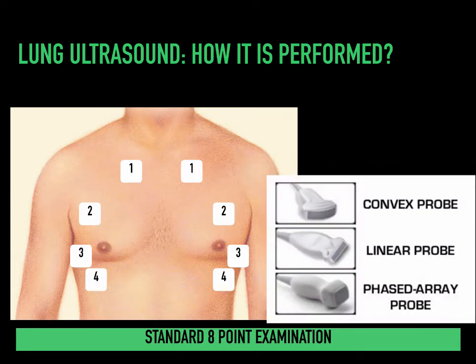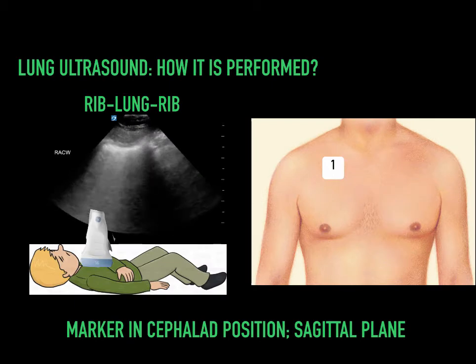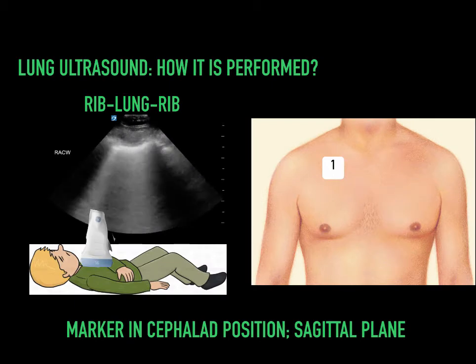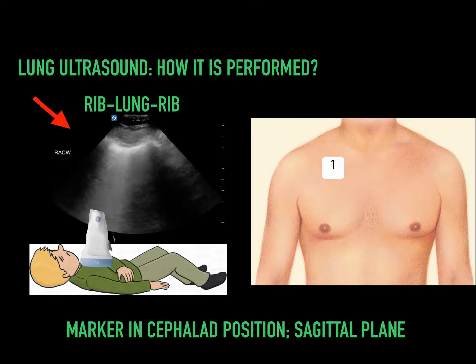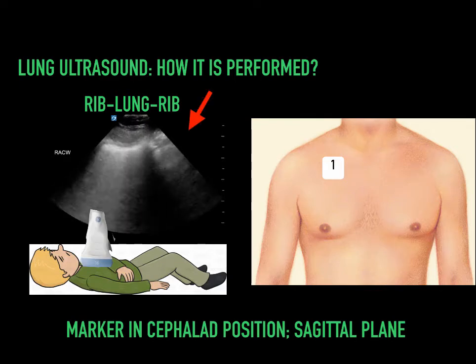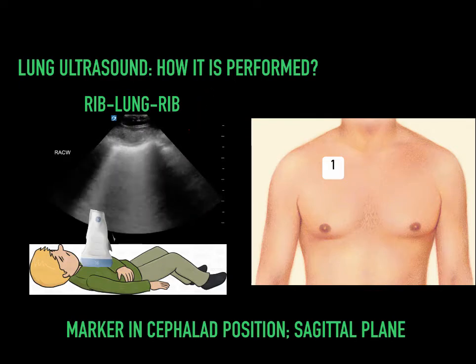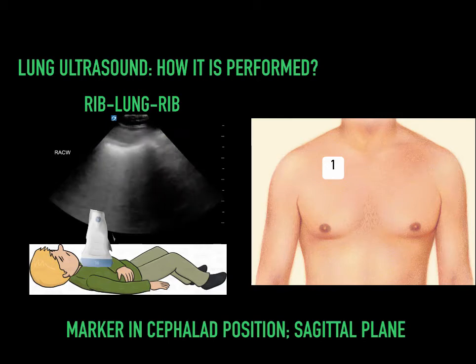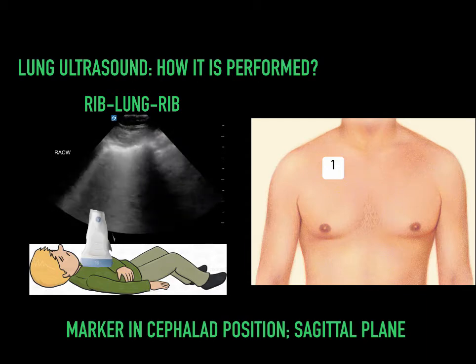You could use a variety of probes, but most commonly employed would be the linear probe, as there's high resolution for the pleura, and the phased array probe as its versatility is pretty much unmatched in the point-of-care world. We typically perform it in conventional radiological fashion with the head being screen left and the feet being screen right. In the sonographic image, you can see a rib-pleura-rib shadow, which is fairly characteristic of lung ultrasound and is standard anatomic position.